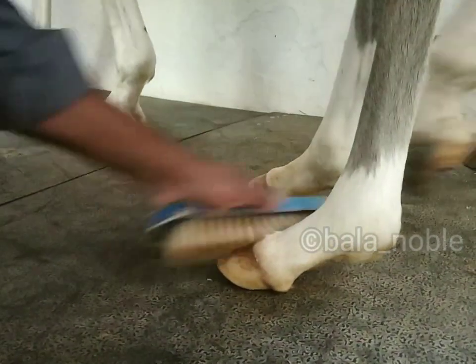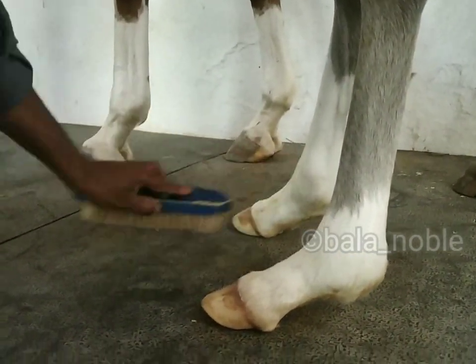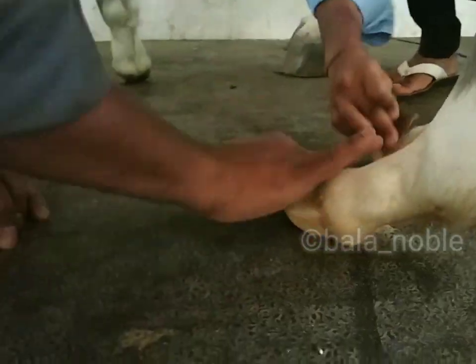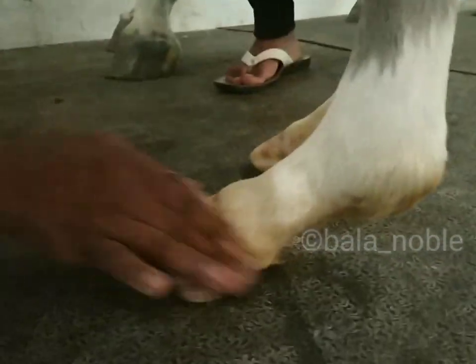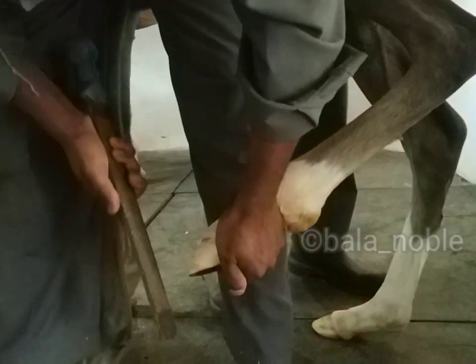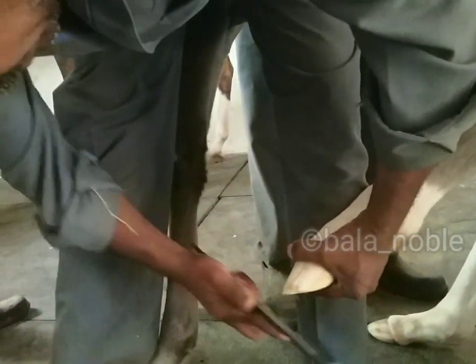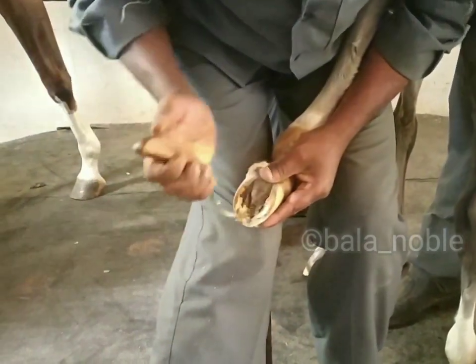Now we are going to apply the shoe. First clean the hoof properly. Remove all the dirty materials from the hoof. Then clean with sandpaper to remove all the fine dirty materials. Then some farrier work — cleaning the wall and the sole — so that the shoe will fit correctly.